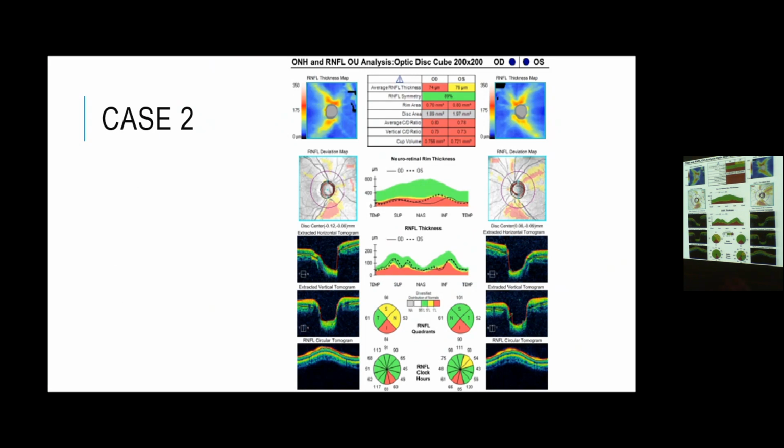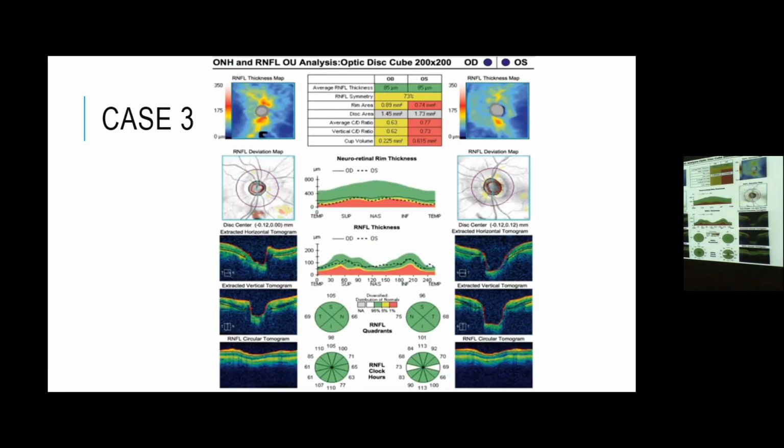Usually in glaucoma they are not exactly the same, as in this case. See, the thickness is the same, the cupping is the same. When you see it, it's most probably physiological, especially if you don't have other abnormal tests. Okay. Third case, who wants to take this?